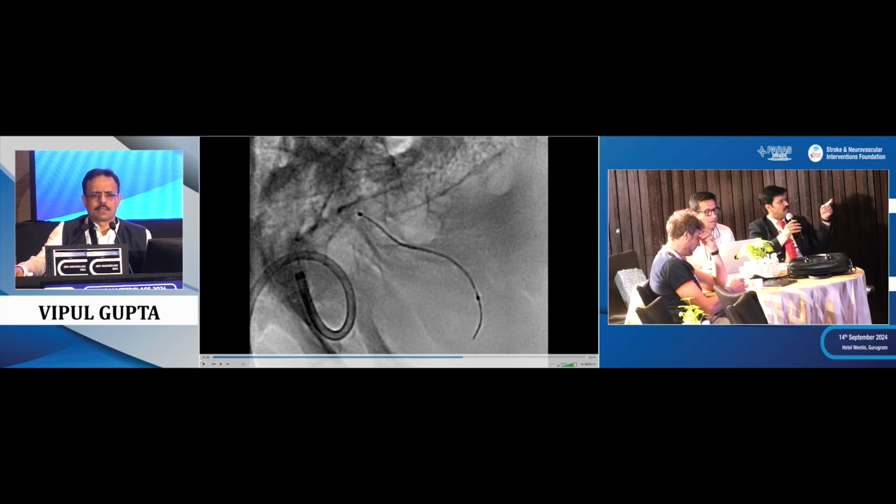I think in this case, you took the next run, and because the anatomy is totally changed, that looks very risky. I agree, these are uncomfortable.